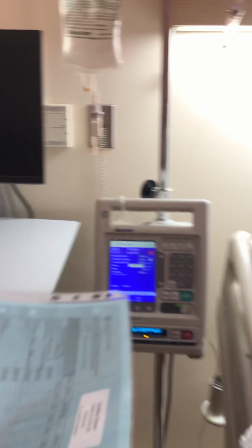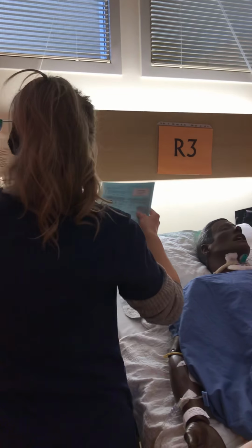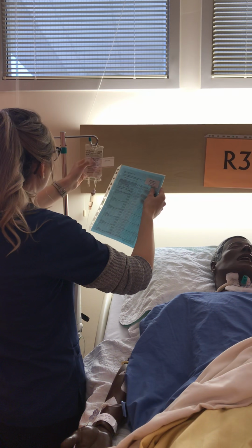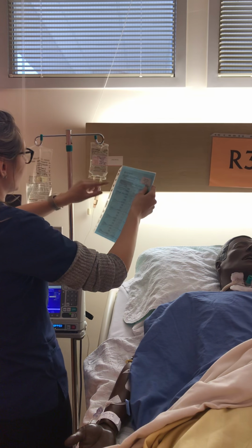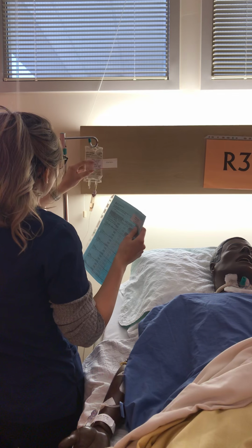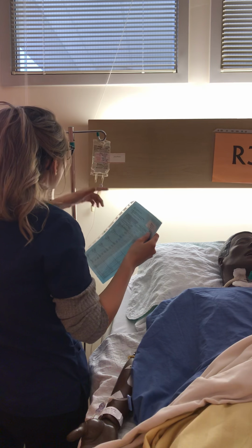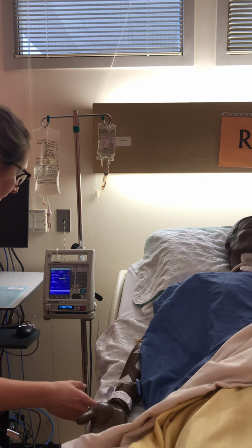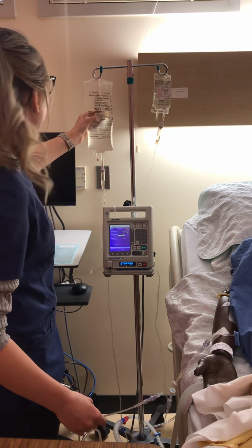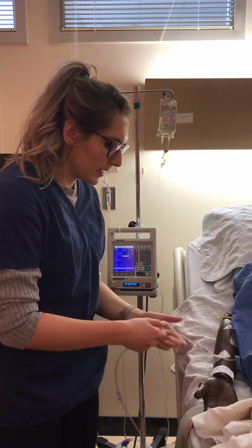Okay, so now before I infuse anything, I need to confirm that my patient has the right medication, doing my second med check. So right patient, Ryerson, Scotland, insulin R, Humulin R, okay, dose is 100 units. We have the 100 units running at the 2 units per hour, as per ordered. 100 ml normal saline plus the 1 milliliter, so that's 101 for a volume, or concentration of 0.99 units per ml. And the time is now, and the route is going to be through peripheral IV. Okay, so my Y port and my bag here is already primed. The date, time, and initials of the nurse are accurate on here, so that's good. So I already know that this is running and that the vein is open.